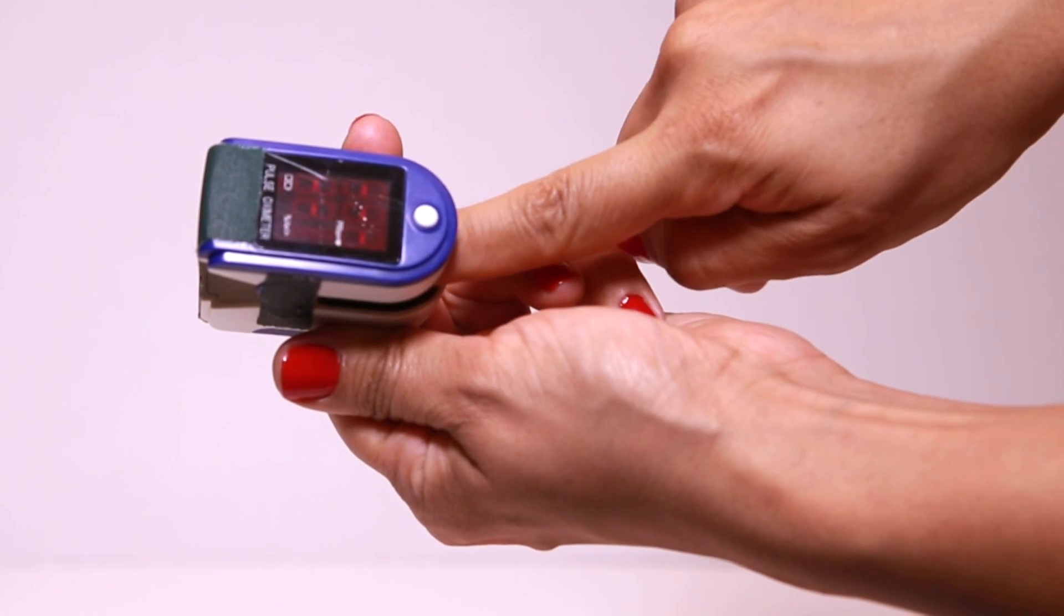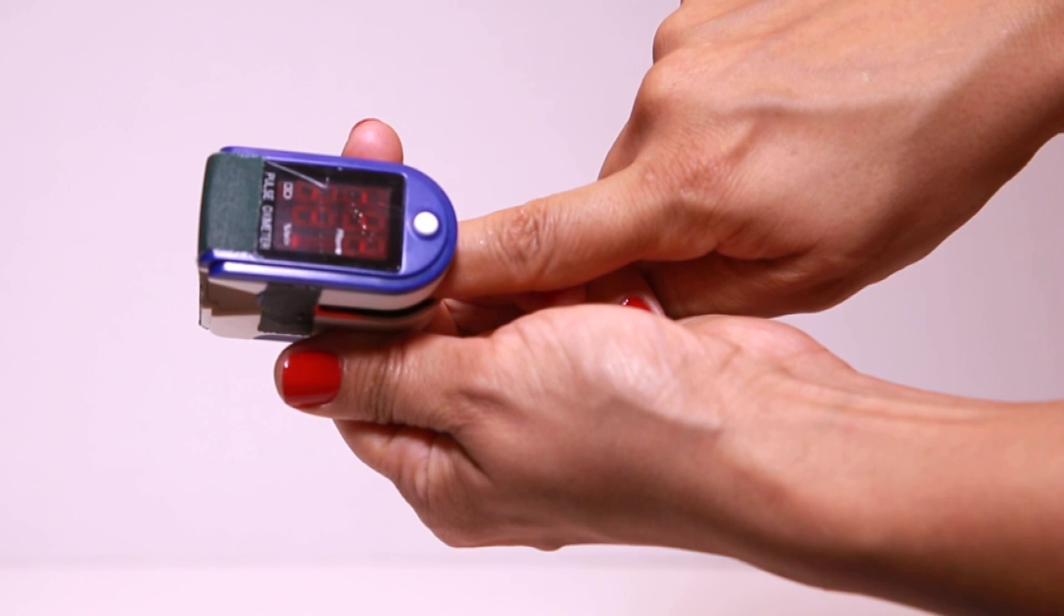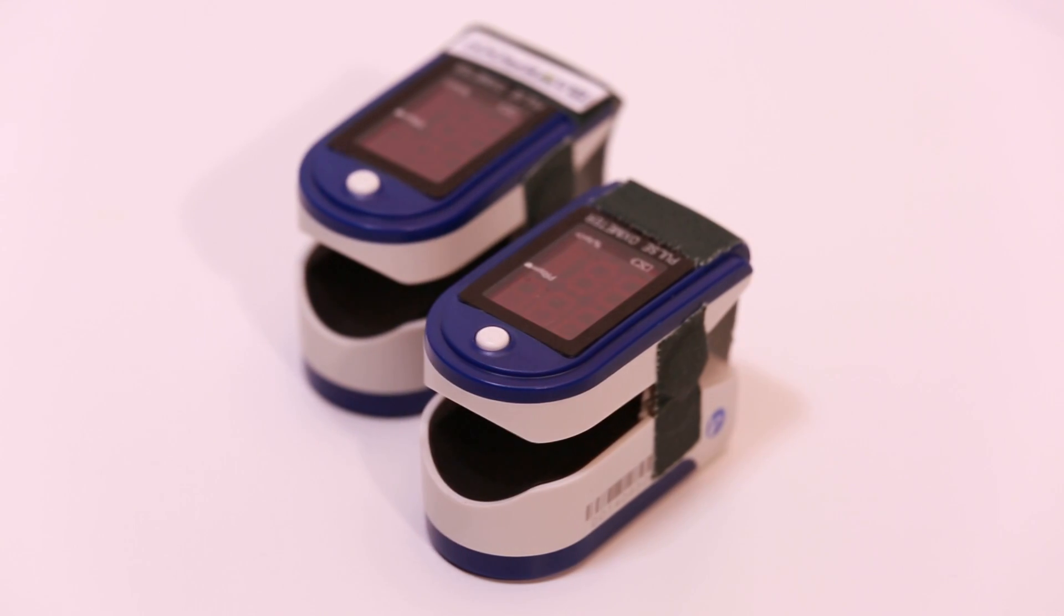For those who may not be familiar, a pulse oximeter measures both the amount of oxygen in the blood and the heart rate.